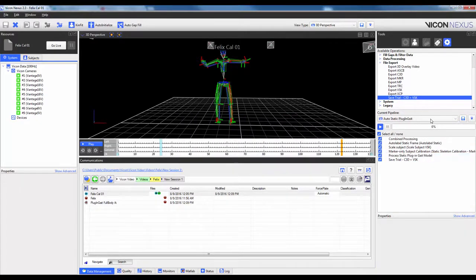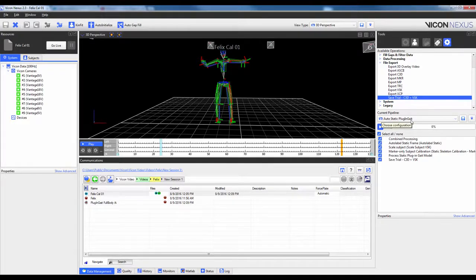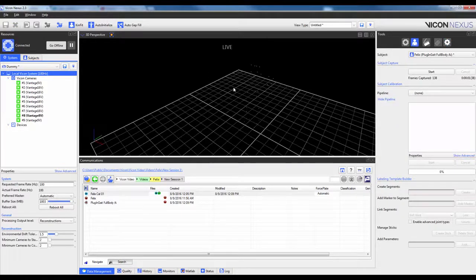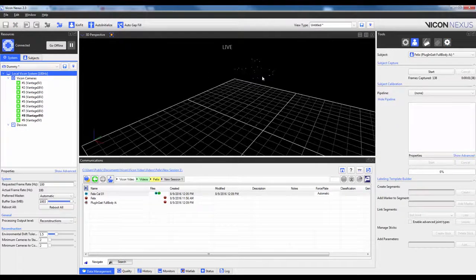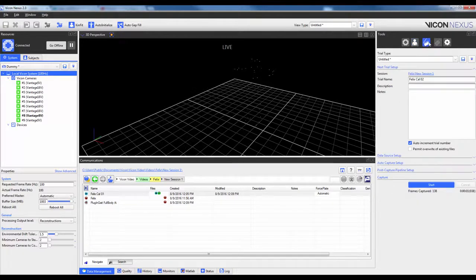So you can see now I actually, in my pipeline list, I have a new pipeline that's called Auto-Static Plug-in-Gait. So now I'm going to go ahead and go live, you can see my subject is still there in the Motorbike pose. I'm going to navigate over into the Data Capture tab.